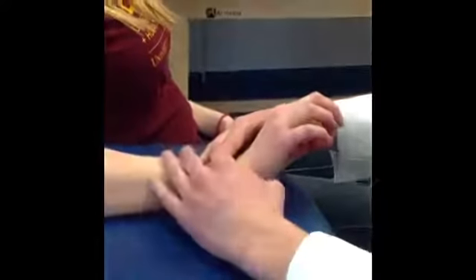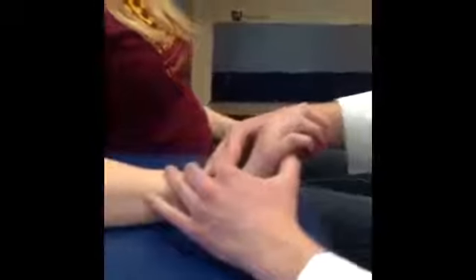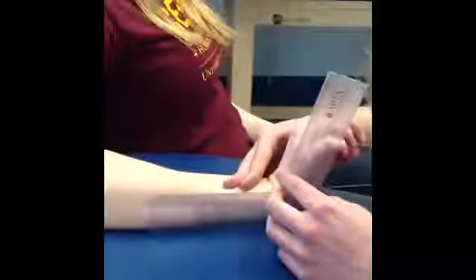And then for the passive range of motion, pretty much the same thing, except you're going to come in and just have her relax again, relax your fingers, everything like that. And you're just going to disperse that load of force across her metacarpal heads again. You're stabilizing there. And then once again, come with the goniometer.